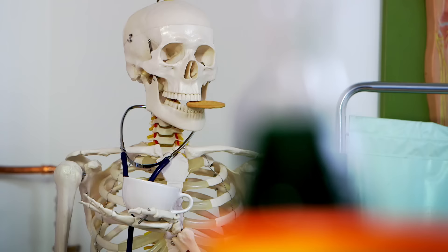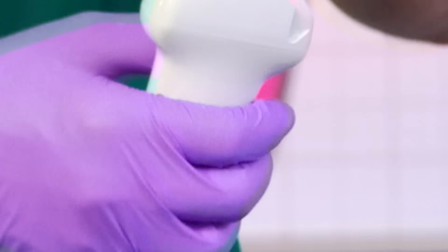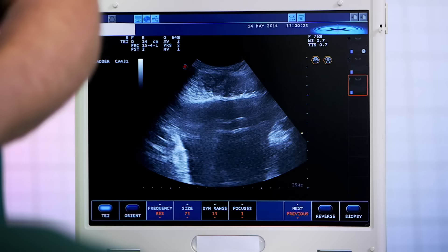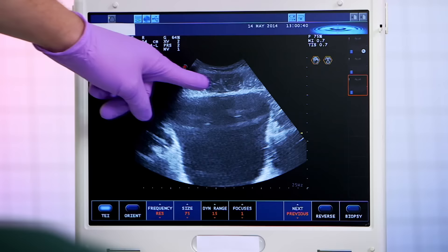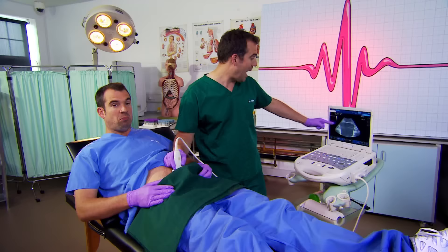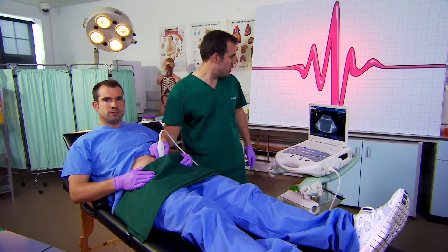I've been giving Chris lots of tea because I want to use his bladder to show you what happens when we empty it. I'm going to use an ultrasound so that we can see what Chris's bladder looks like now that it's full. What you're looking at here: these top layers are Chris's tummy muscles, and then below here, this big black blob — that's all of Chris's bladder. It's full of clear liquid, which is urine.